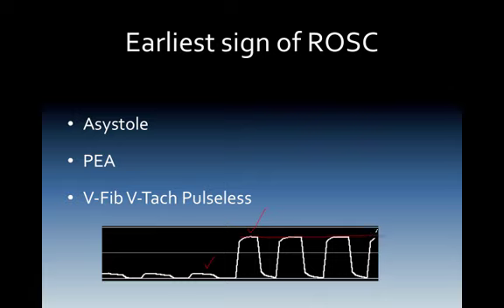So watch your capnography best you can. If you see an increase in end-tidal CO2, very simply, you could have just had an ROSC. Finish up your 2-minute cycle and then check for a pulse.